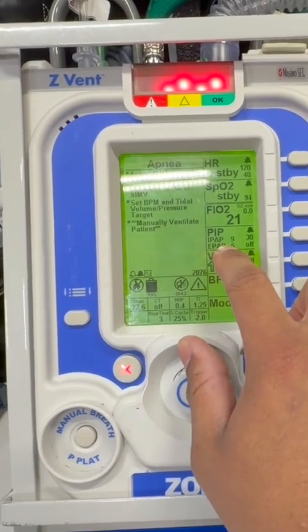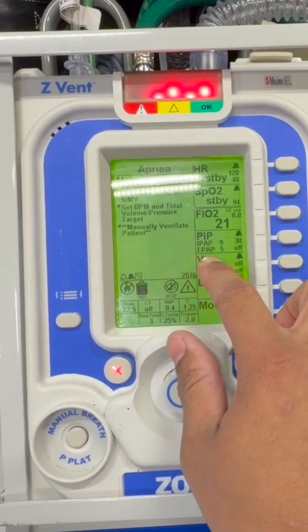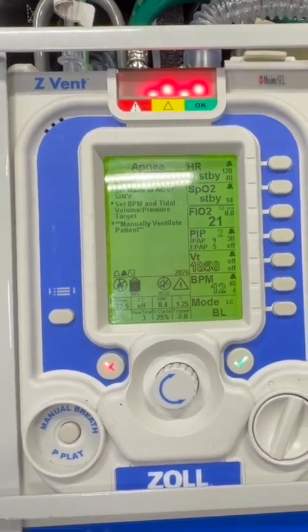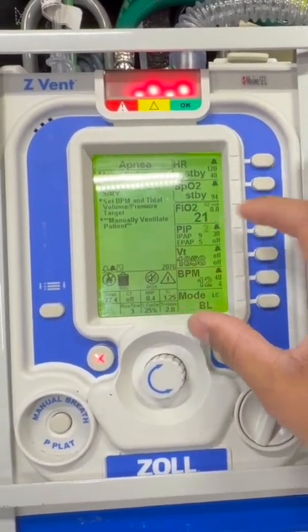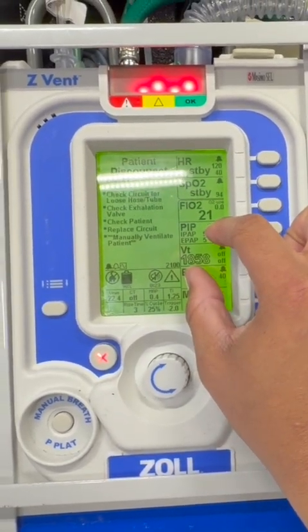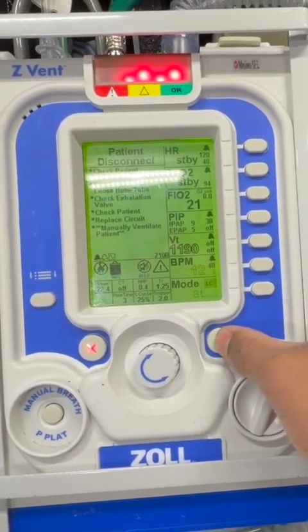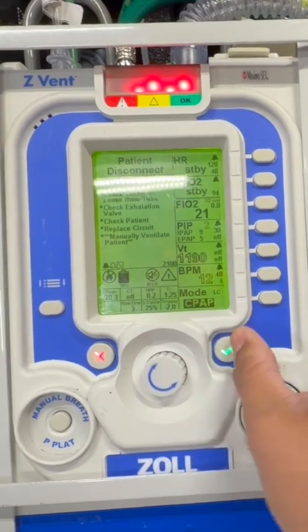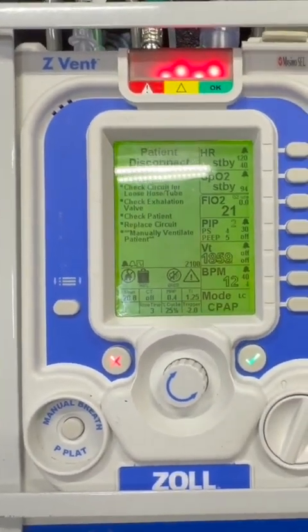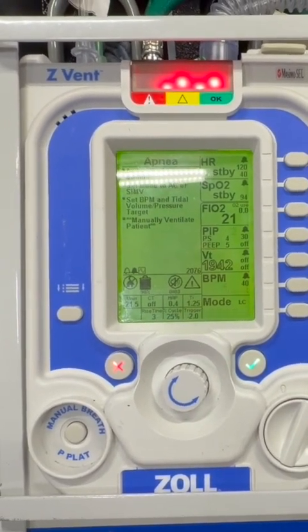It's the full pressure. So now IPAP, which is the same as pressure support in CPAP mode, is now 9 and EPAP is 5. The numbers are actually, you're doing the exact same thing to the patient. It's just that based on the terminology used for Zoll, in bi-level mode, IPAP is the total inhalation pressure versus CPAP, which is additive. They do the exact same thing. You can just choose whatever way you want to meet the needs of the patient from either the CPAP or the BiPAP setting.